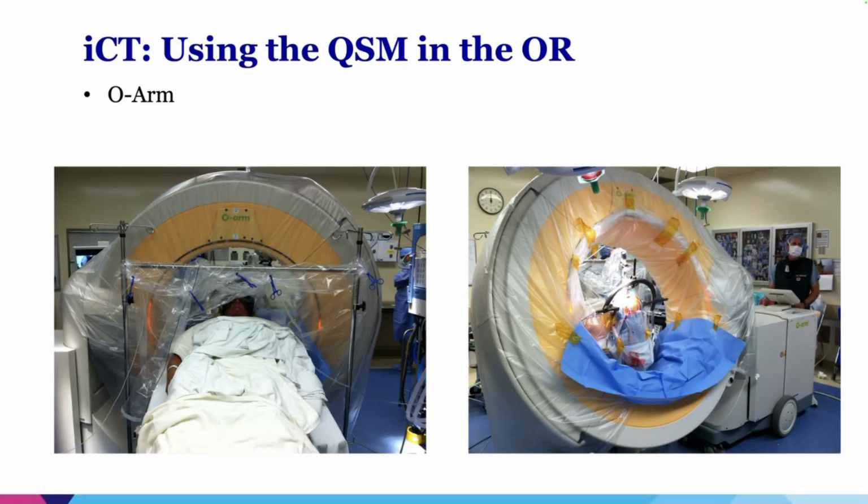As far as shift is concerned, shift for STN and thalamus cases, I think, is minimal to non-existent from a clinical standpoint. GPi can be a little tricky sometimes with shift, but really most of the time not. For some other cases that I've been doing with subcallosal cingulate, where it's right near the pole of the brain, yeah, shift can be a little tricky, but that's beside the point.